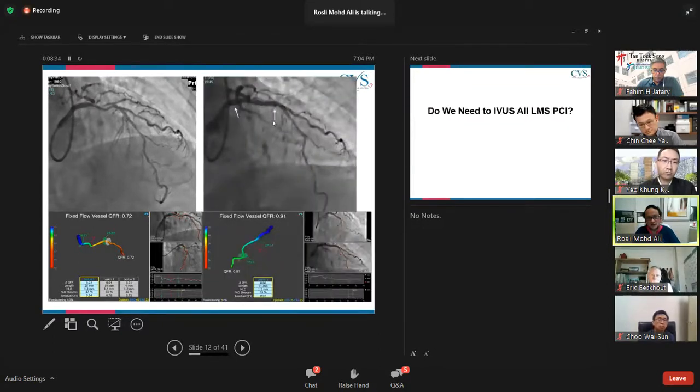So in this case, we just stented until the body, and we did not have to stent until the left main stem. So you don't really have to stent in all cases until the ostial left main. But if you were to do imaging, intravascular ultrasound, that will give an idea whether you need to stent into the ostium or otherwise. A bit more confident in that sense.